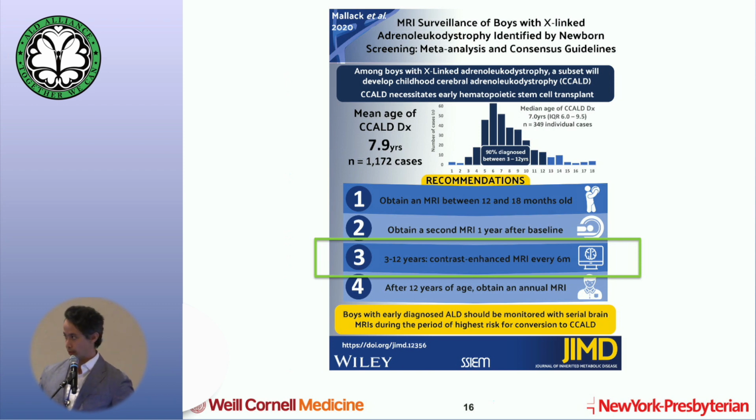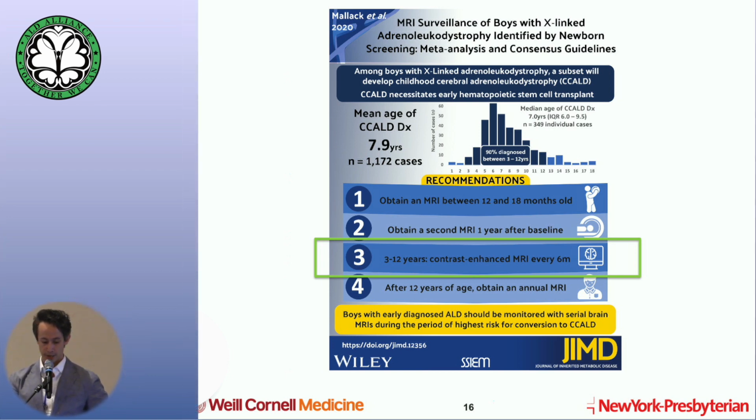The major considerations are exposure to gadolinium and exposure to anesthesia, and the strategy by which you either make use of a patient being anesthetized for an image and do all the sequences, or do non-contrast imaging. Then if a patient develops a lesion, you have to anesthetize them again to get the contrast-enhanced scan. There was a lot in those couple of sentences, but I can explain further in the Q&A portion.